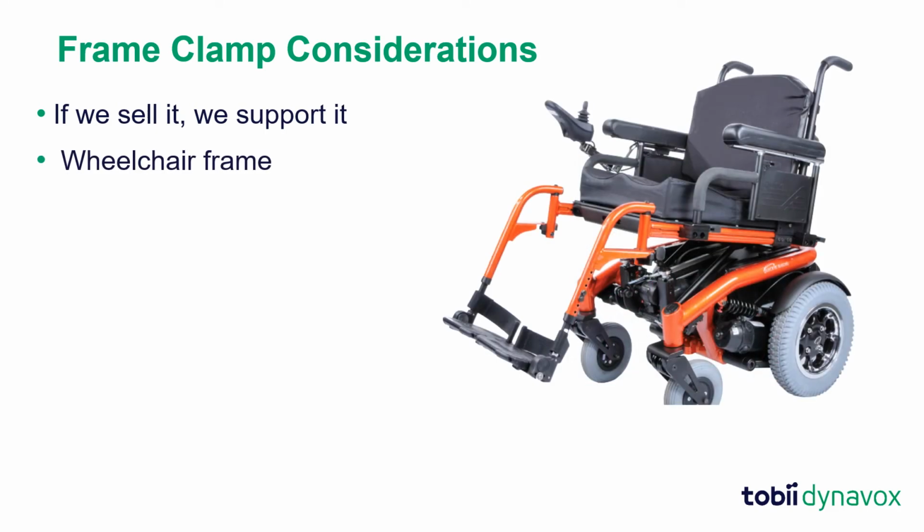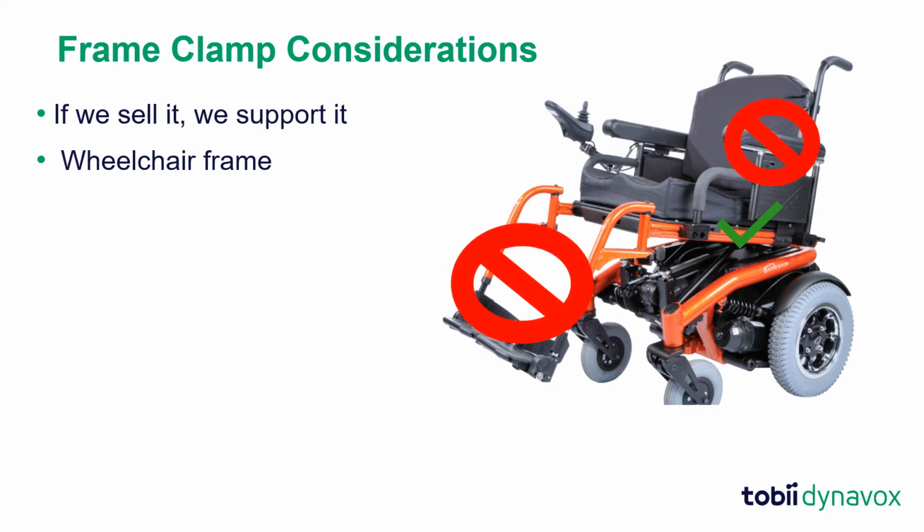As noted before, a frame clamp should only be mounted to the frame of the wheelchair. Items such as footrests, armrests, or any other non-frame component should not be considered as a location for the frame clamp.